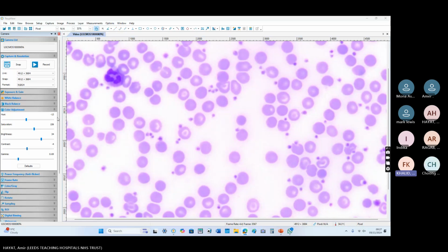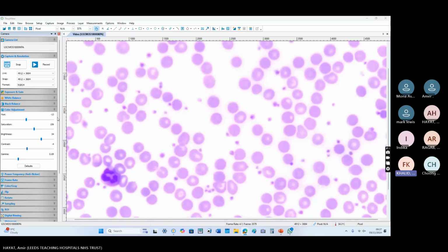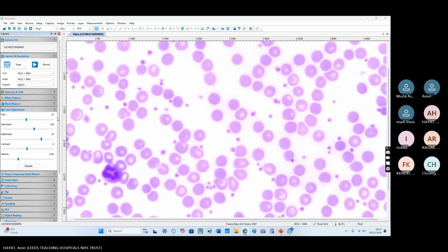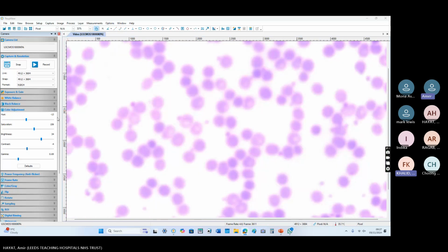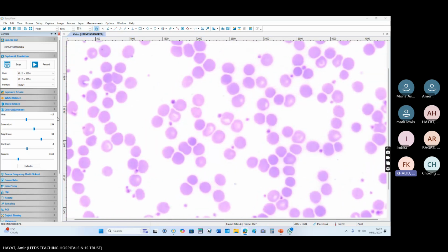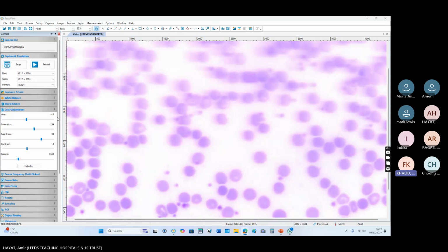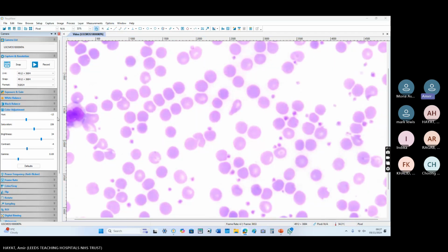Yeah, they look all right-ish. So neutrophils do look fine. I would suggest a hematology screen, look for causes, to rule out bleeding and viral infections. Send for hematology, DCT, liver screen, and then iron studies.